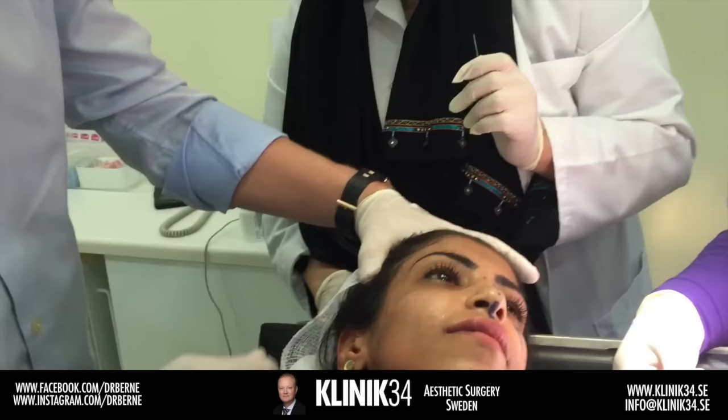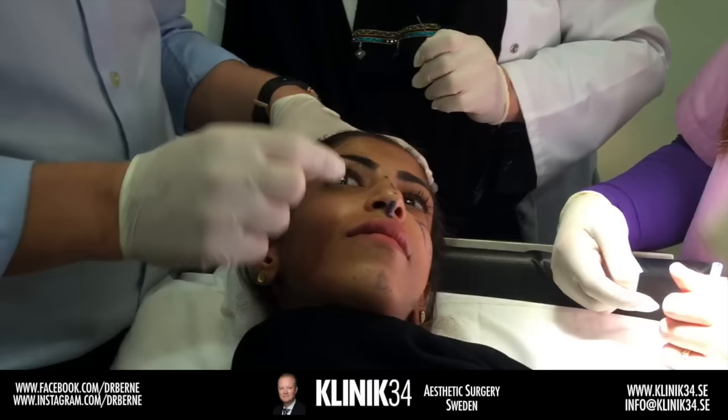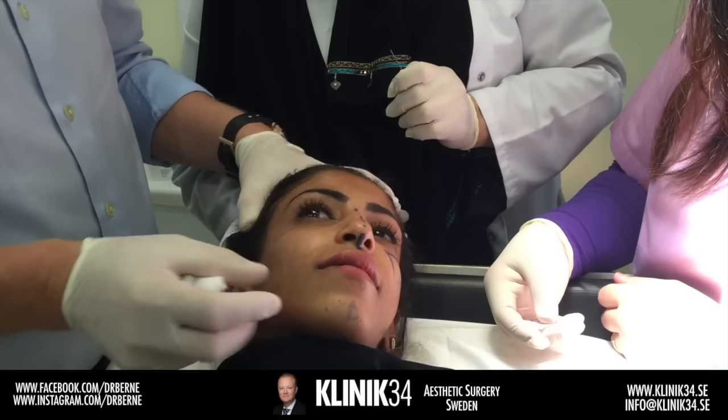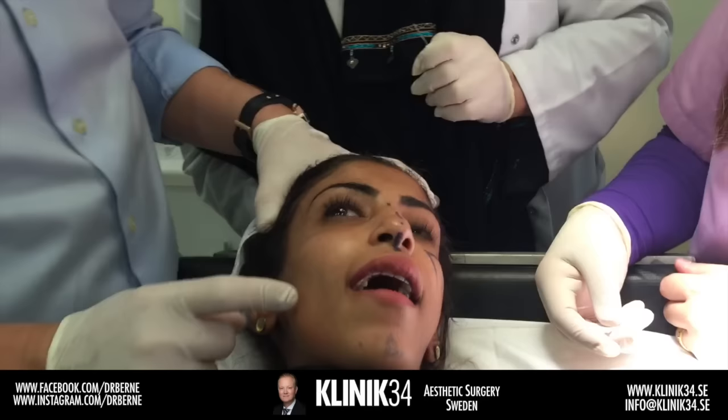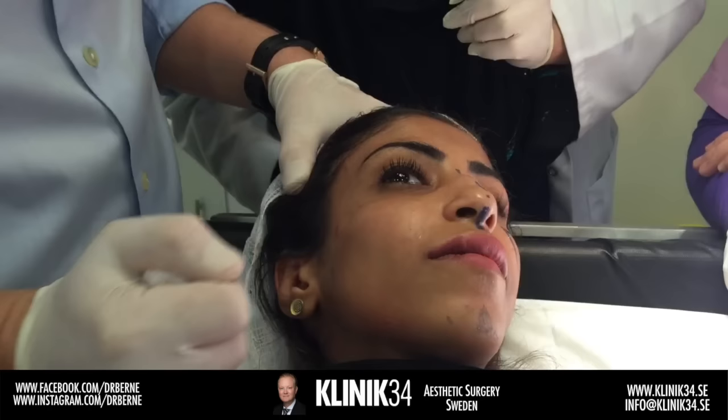We've definitely created some shape there. This area has very little support, so to create a feminine shape we want to avoid injecting too much here. Some patients have hollowness and we can add a little, but there's no support here so we must be gentle. The point is to create better bone structure — adding volume here and here — and then the next step is the chin and then the nose.